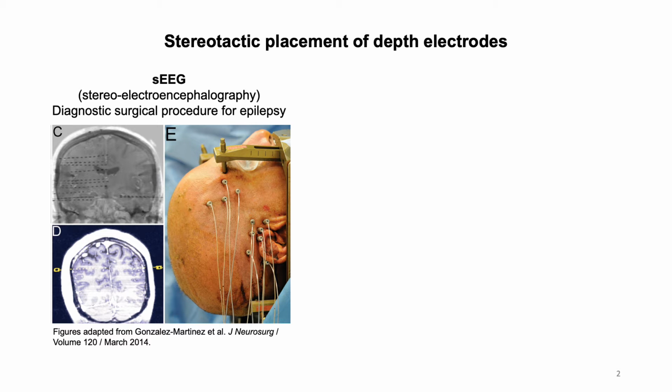For some patients with epilepsy, medication doesn't control the seizures. So in these patients, physicians have to start looking at whether there are other treatment options available, such as surgical treatment, which can actually offer a cure for epilepsy. Evaluating a patient for surgery includes a large team of specialists, but also a diagnostic procedure, SEEG, stereoelectroencephalography, that is electrical recording of the brain activity with depth electrodes to try to localize exactly where seizures are coming from.